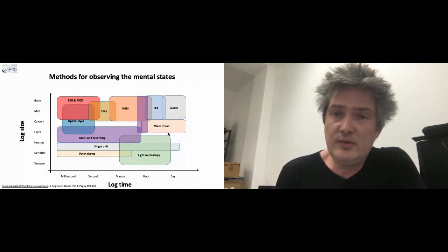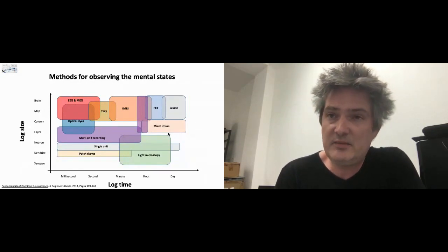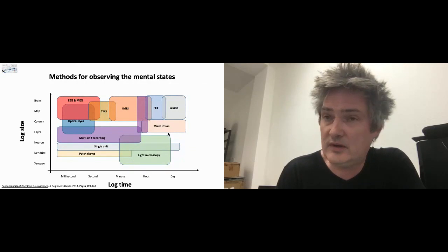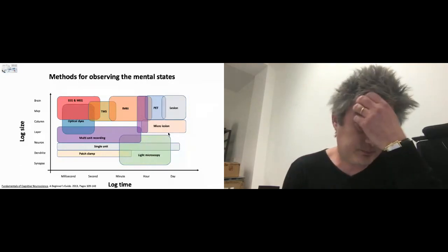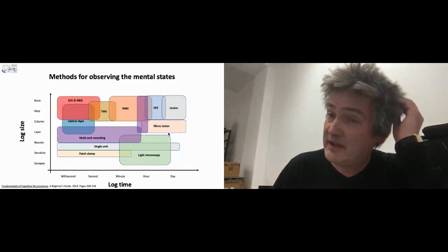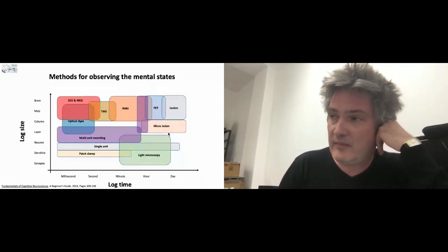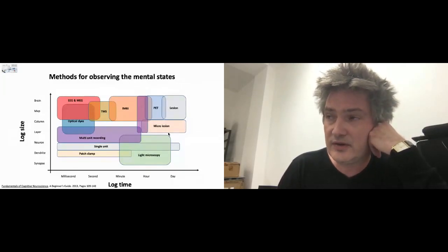On the other hand, if you study decision making using single unit activity, you will have a very precise timing, from the millisecond to sometimes hours. But the problem is it will be difficult to map and record all neurons within the same or even between different brain regions. So there is a question about what we call decision, but also about what methodology we use to study decision. What I will try to illustrate today is something that has been published or is ongoing research that I think may be interesting to causally study the way a decision is made in the brain.